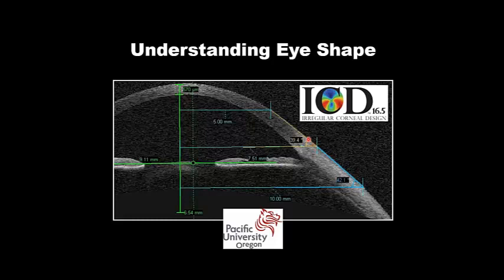You might also notice that we don't see a defined limbal junction. Here's clear corneal tissue where you see the whiter density of these pixels. That's where we have sclera, and in between, somewhere in here is the limbus. And we've generally been taught that the cornea, the curved cornea, meets the curved sclera, but that doesn't appear in the vast majority of patients. So one thing that the ICD is constructed based on is a knowledge that the peripheral cornea, the limbus, and the sclera are more tangent in shape rather than curved in shape.